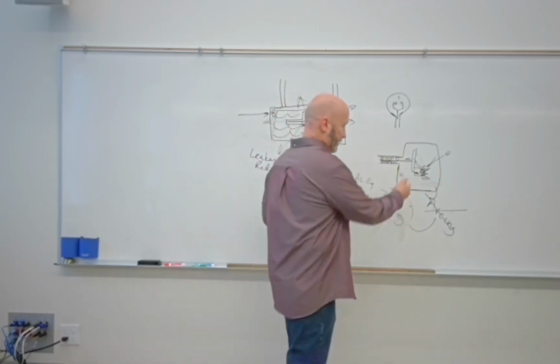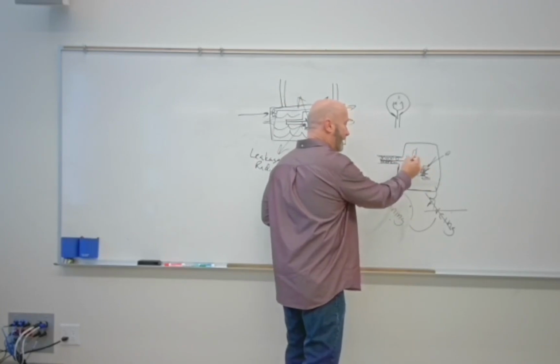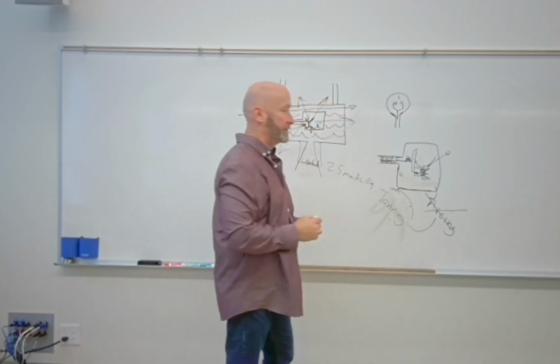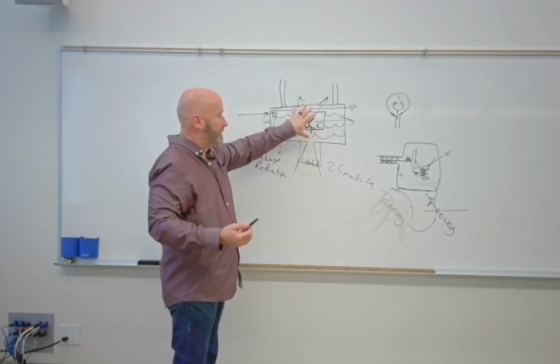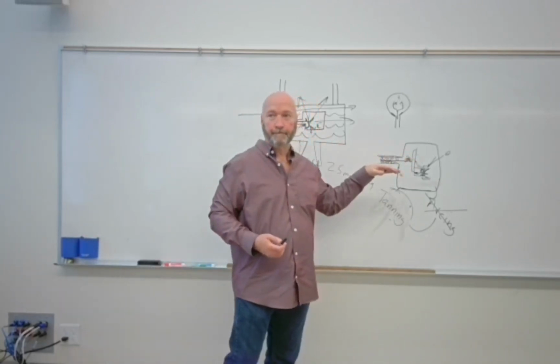We're going to create heat and they're going to get hot, but we want to try to stop the heat from going down the stem and getting to those bearings as much as we can. Okay, it's still going to get hot because it's still inside of all this, but we want to prevent at least that portion of the heat.